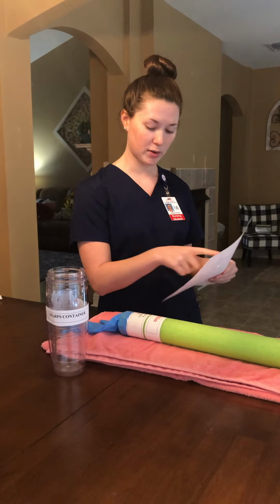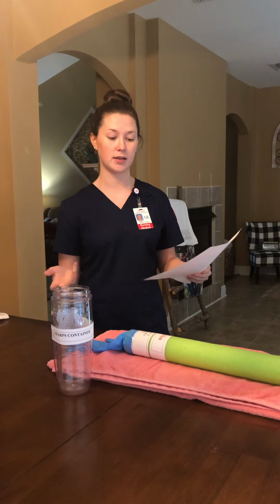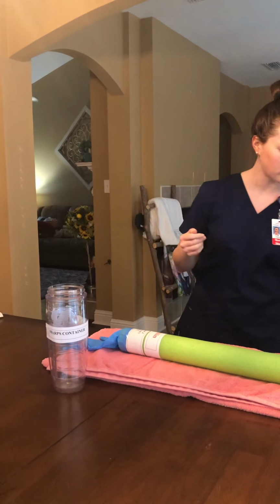So it says he's allergic to penicillin, and penicillin is on here as well. I would want to ask my patient if he was allergic to anything else that wasn't listed, and I would want to explain the procedure to the patient and provide them with privacy.